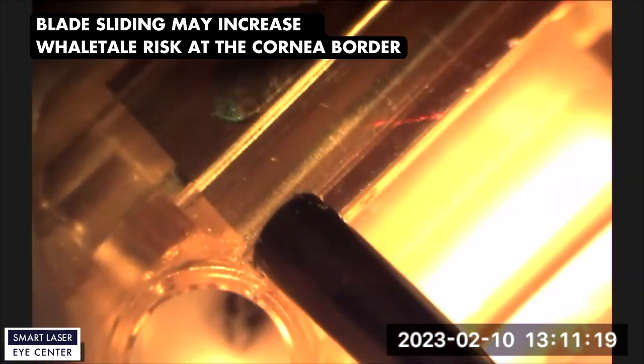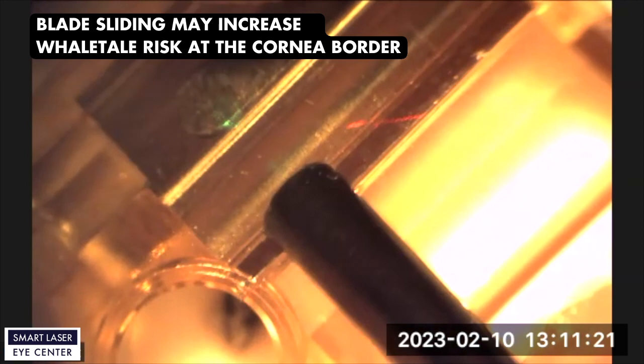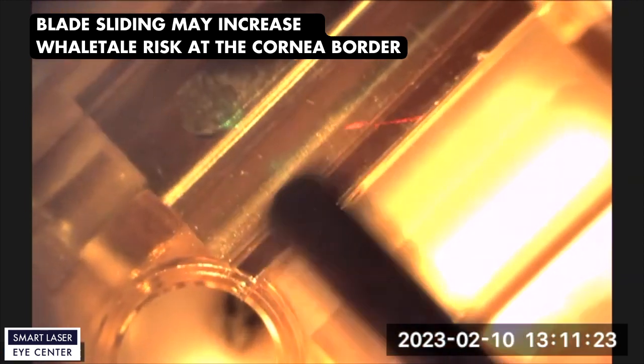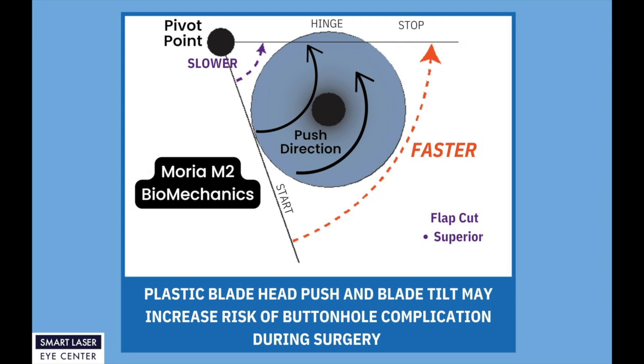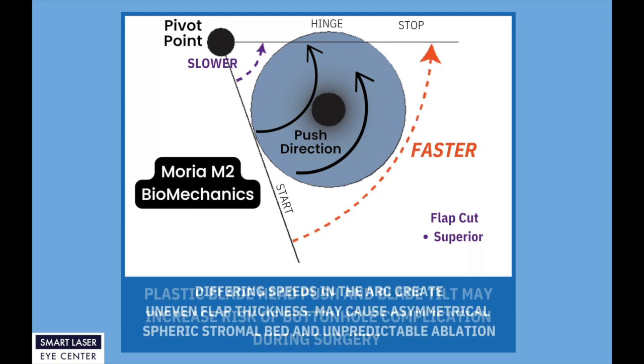Also, plastic head blades easily slide left and right, which may cause whale tail or irregular cutting edge risk during surgery. Blade tilt and the plus and minus 25 micron tolerance may also increase the risk of buttonhole complication during surgery. Additionally, differing speeds in the arc principle create uneven flap thickness, which may cause an asymmetrical spherical stromal bed and unpredictable ablation.